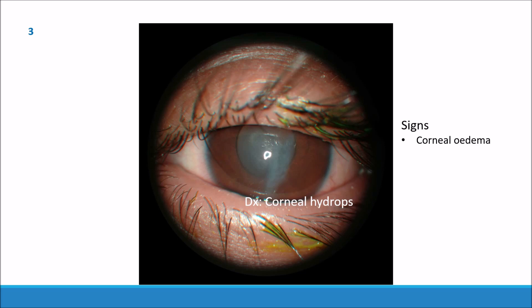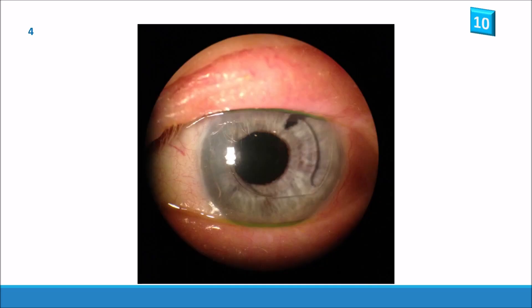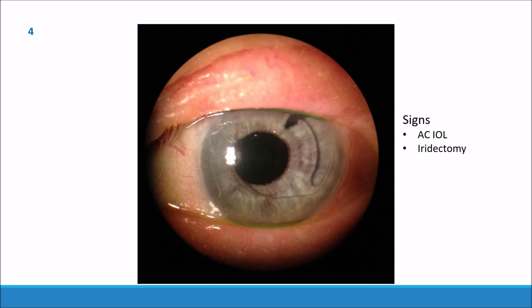Slide number four. So there isn't a true diagnosis here but more signs. We have an anterior chamber IOL and you can see the haptics here, plus an iridectomy. Don't get confused with an iridotomy, which is made with a laser and is smaller.